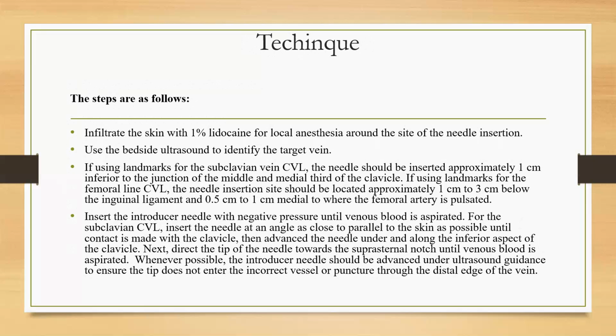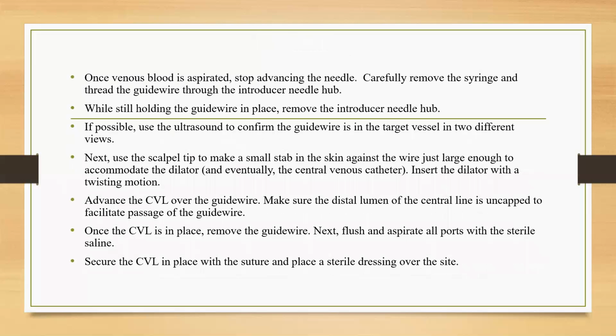Whenever possible, the introducer needle should be advanced under ultrasound guidance. Ensure the tip does not enter the incorrect vessel or puncture through the distal edge of the vein. Once venous blood is aspirated, stop advancing the needle.